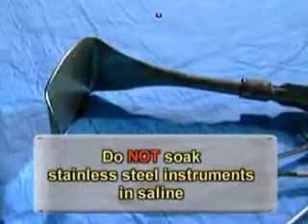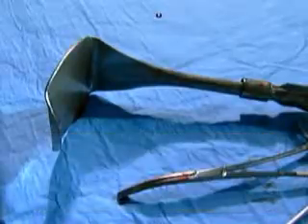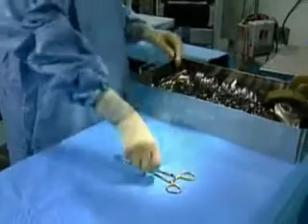Stainless steel or other metal devices should never be soaked in saline. The chloride ions in saline will cause rapid corrosion of the metal. Initial decontamination of instruments should begin immediately after the completion of any invasive procedure.